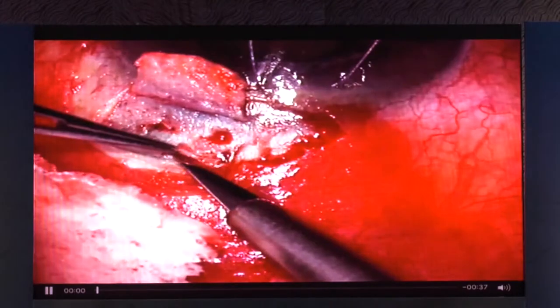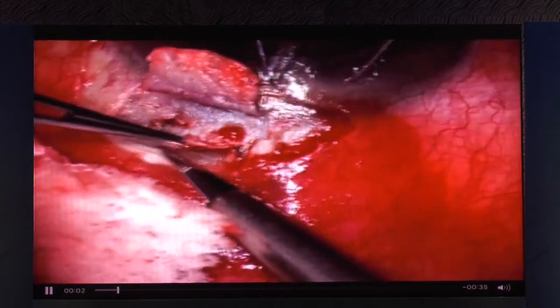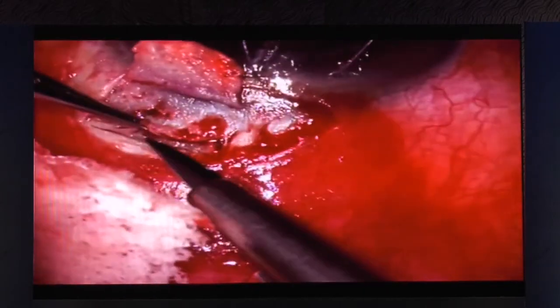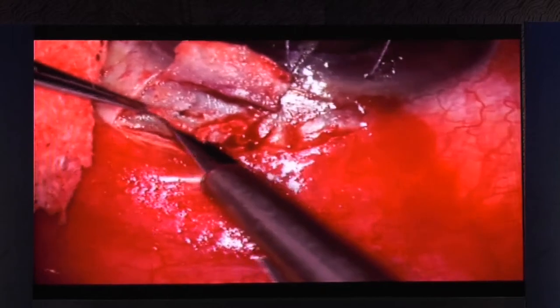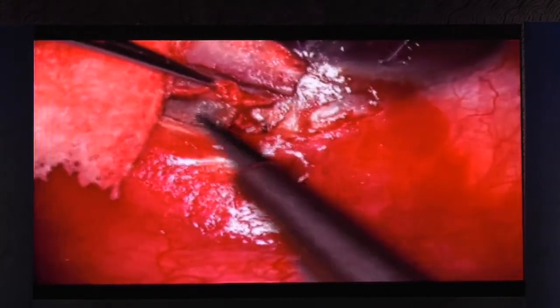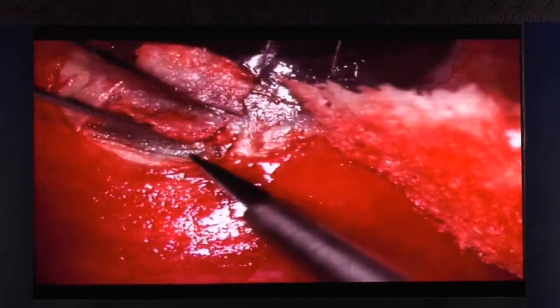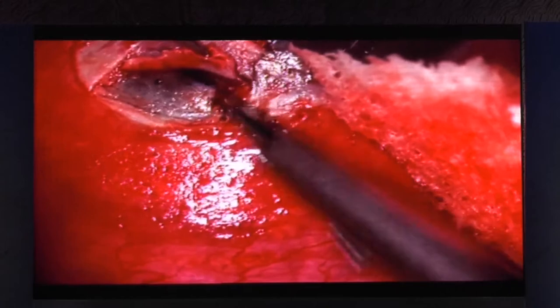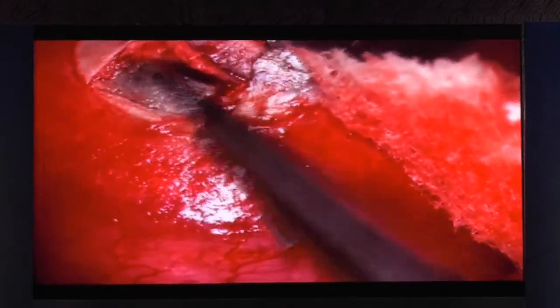So in this particular case, the resident created too thin a flap, or so the attending felt. So what he did was to create a second layer. And by creating a second layer, you essentially have much lower chance. You have more tissue to hold, less chance of you tearing it out, less chance of you causing avulsion of the flap. My opinion, it has gone a little too deep, almost deep sclerectomy level in my opinion, but hey, that's fine. That's one option.